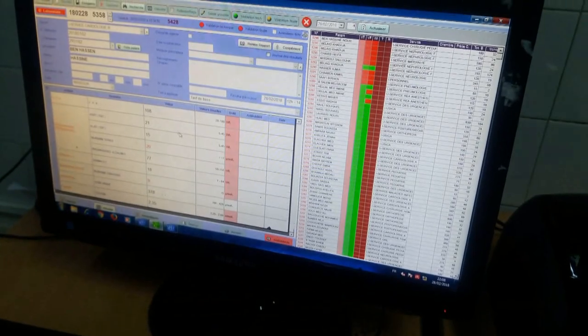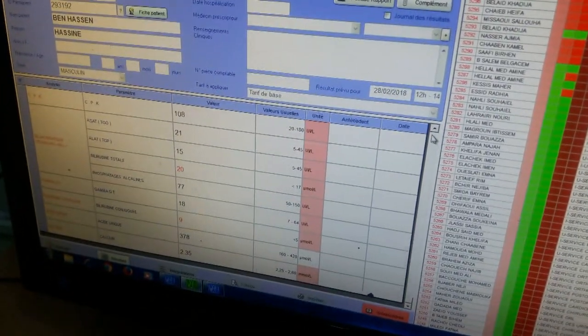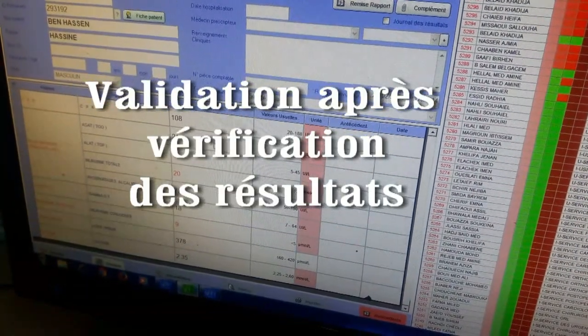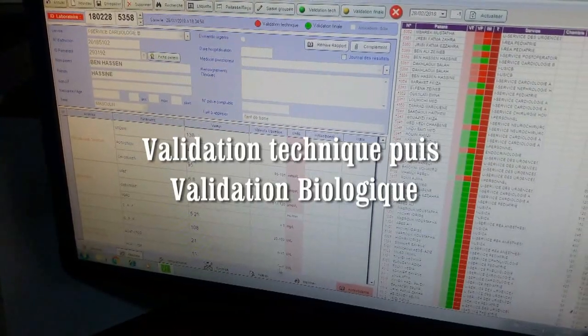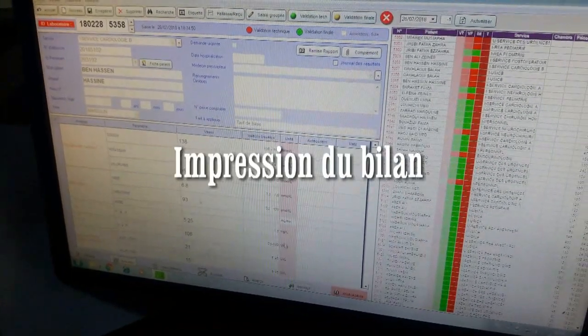Les différentes valeurs des différents paramètres saisis seront transférées vers le logiciel informatique. On peut ainsi valider. Après la validation, on imprime le bilan — on appuie sur le bouton imprimer.